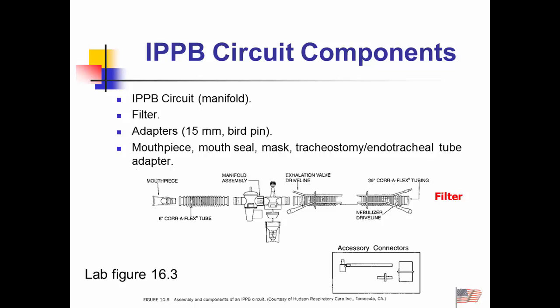This is my nebulizer. During the inspiratory phase, I want to have 2 things happen. I want the nebulizer to start nebulizing. I want to be able to have medication being delivered to the patient. And the second thing I want to do is I want to close that valve. The little jumper cable will end up allowing us to do both. And again, when I go through a demo on this, then it will probably make a little bit more sense.